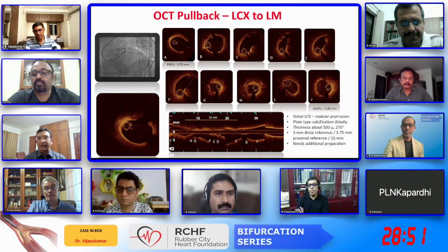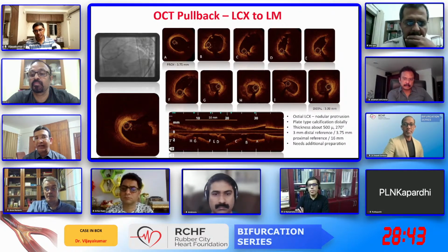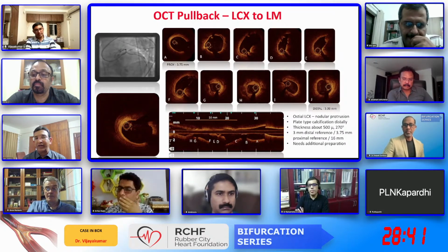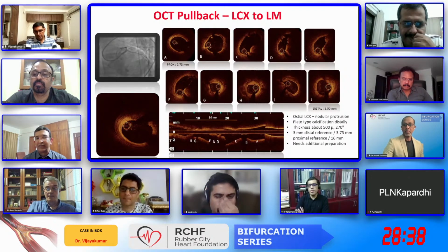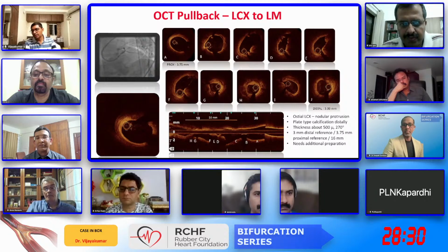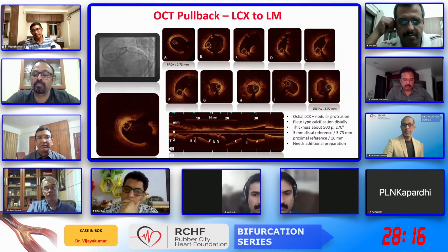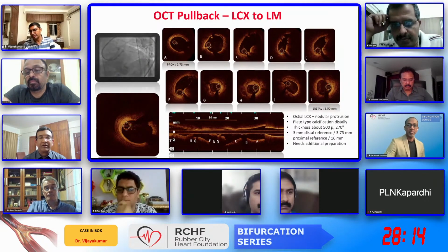It's a nodular calcium, isn't it, Vijay? Yes. So what kind of preparation are you looking at? Because IVL for nodular calcium is not really great, and rotablator, I'm not sure, unless you have a good bias you would get a good result. Yeah, not rotablator, I'm not very sure. You can see the imaging catheter is not hugging the calcified nodule, and unless you alter the wire bias by adjusting your wire position. And with orbital atherectomy, they say that you go in, and when you come back and ablate, this type of calcium cuts very well. But unfortunately, we don't have any experience with that. It was even discussed yesterday in the meeting.